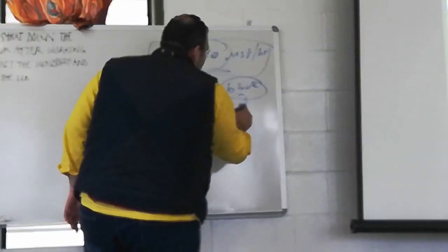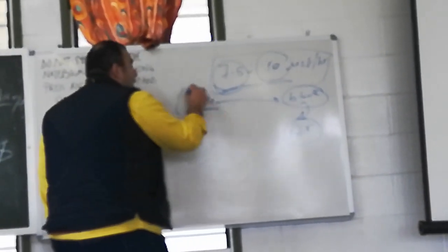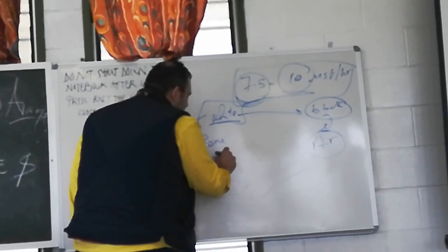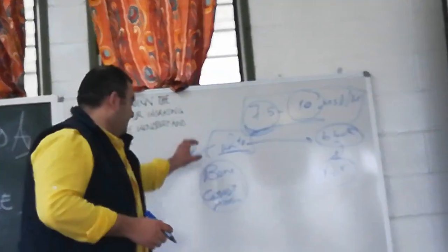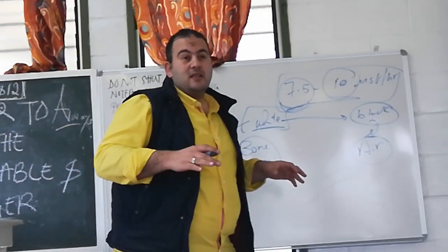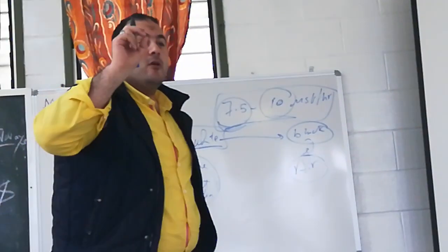Black represents low density, like air. White represents high density tissues like bone or contrast media, or metals and other high density objects. Very low density objects, like air, are represented by black color. In between, you will find the gray scale, different degrees from white to black. Each degree represents a tissue.